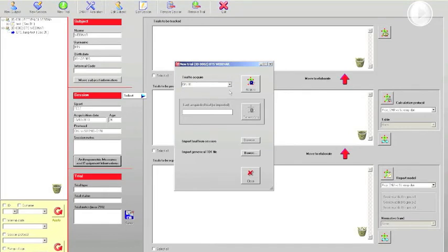So we are going to perform the two acquisitions. I'm going to show you the video recording while we are doing our test, and we will see the analysis and the reporting, okay? So let me show you completely my screen in order not to lose any tab that is going to be open, and I will click on acquire. It takes a little while to have all the windows open.